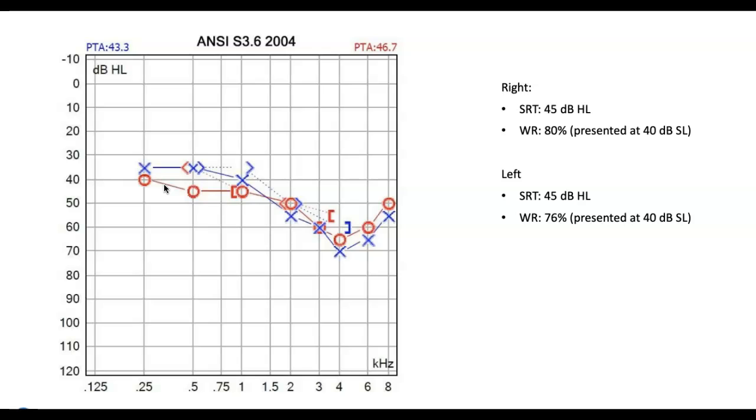All right, so here we have, let me see, are there any air-bone gaps? It's a little hard to see, but really no more than 10. Here, 45, 35, 35. Yeah, no. I don't see any air-bone gaps. So here they calculated the pure tone average for you. You look at is it close to the SRT? Now what kind of hearing loss do we have? No air-bone gaps, so this is sensory neural. We have a mild sloping to moderately severe sensory neural hearing loss.